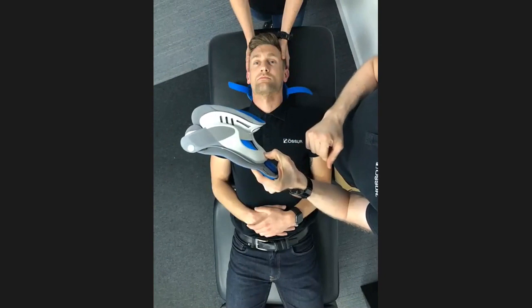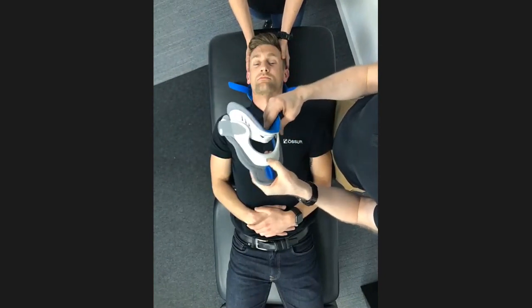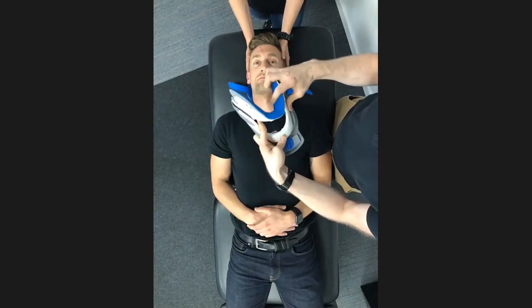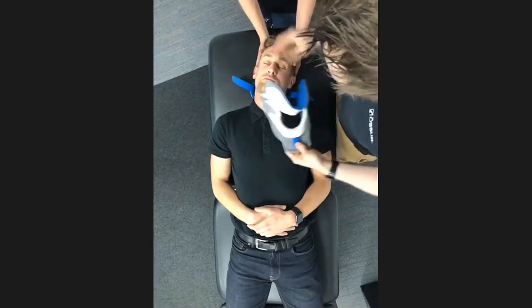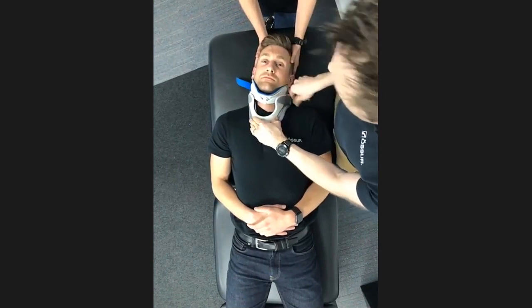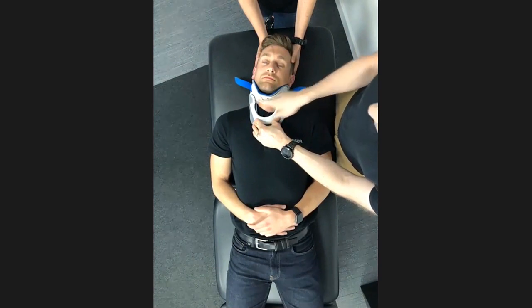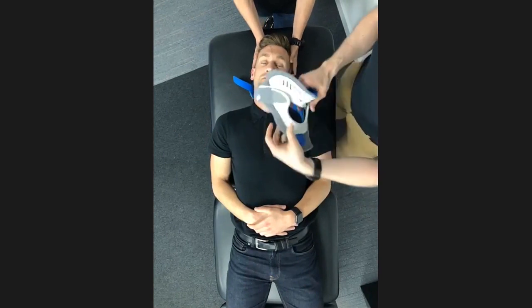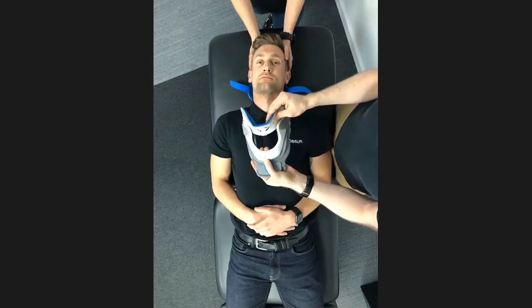It's also important to bear in mind that if the patient is off to one side, so in an asymmetric position, it is fully possible to adjust this to be lower on one side and higher on the other. So if we just move Pete's head over to one side, you can see that we can adjust this to accommodate that positioning. If you notice, it's a little bit lower on this side than it is on the right-hand side. So this can be particularly useful if a patient has torticollis or a condition along those lines where the head is off to one side.